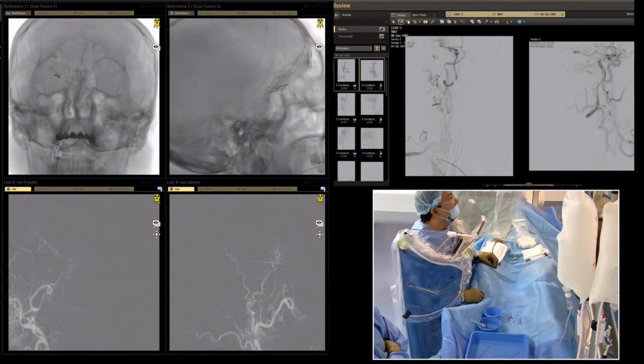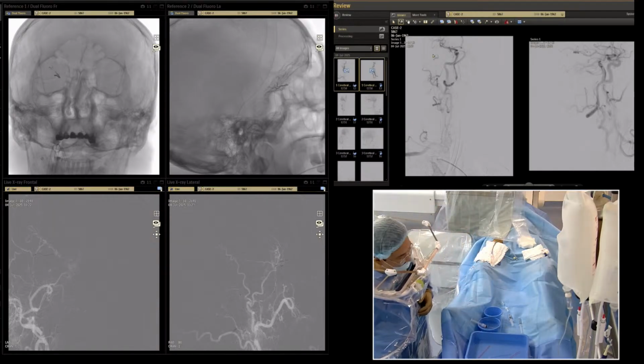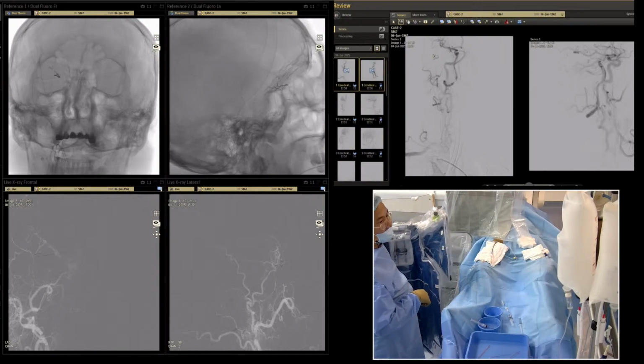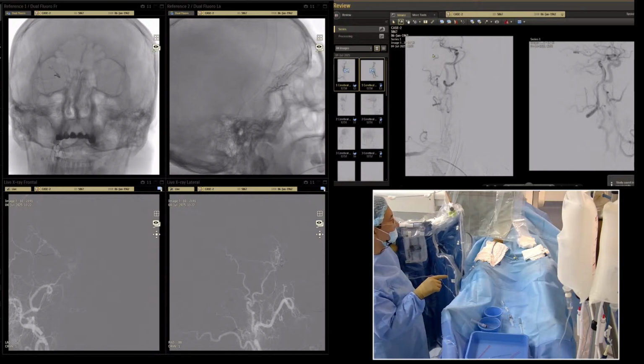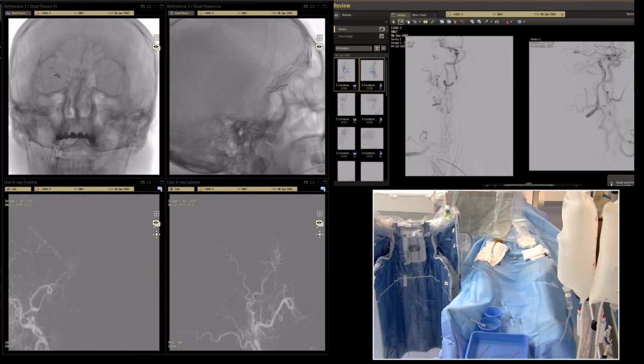The branch might be too small. Okay, I think we need to place a Headway Duo and a couple of coils after and a couple of coils before, and then we can inject through this Sonic. Okay? Headway Duo and Traxx.